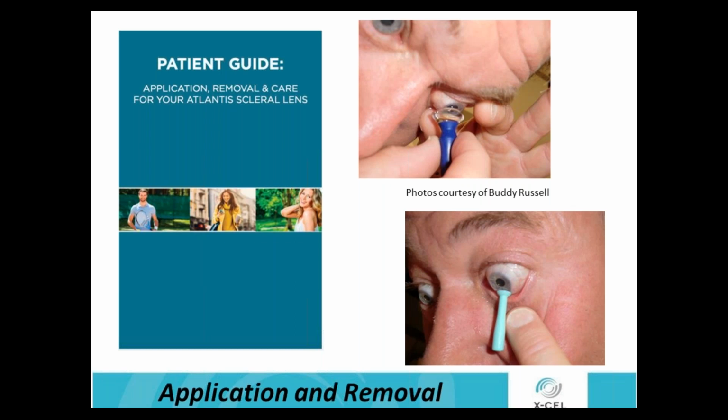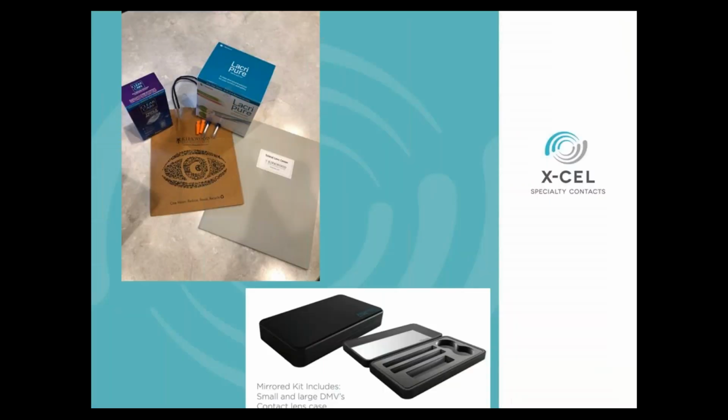It also is giving them the resources that they need. What resources can you provide them to give them the best ability to comply? So not only is that compliance with the application and removal technique, but it's also solutions and cleaning and proper care. So what can you give them on the front end to make sure that their compliance lasts as long as you possibly can?